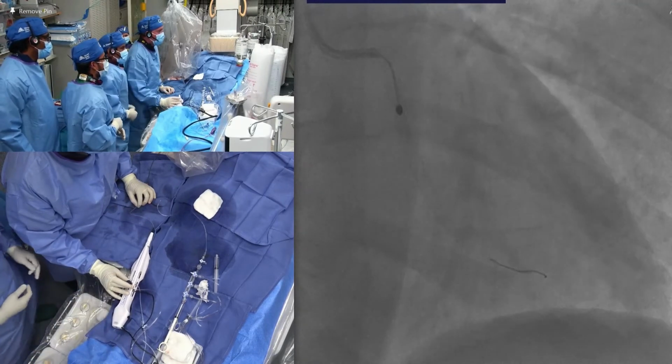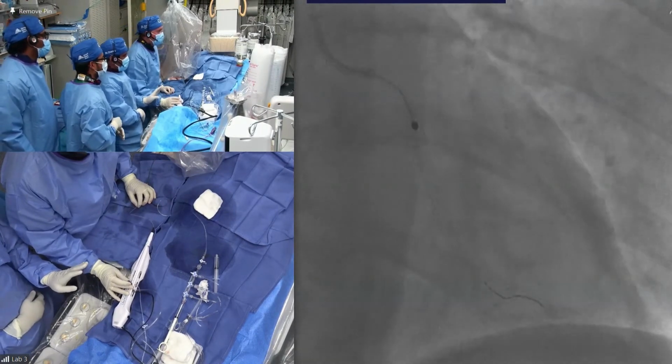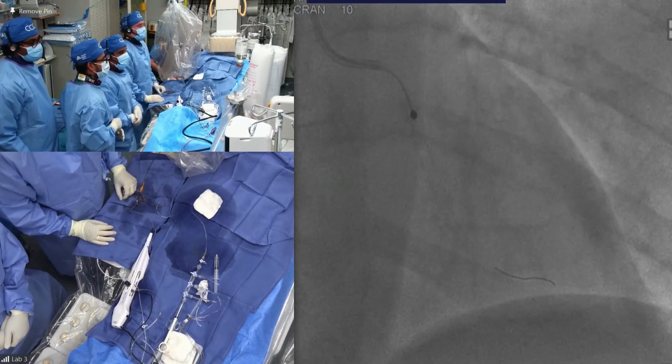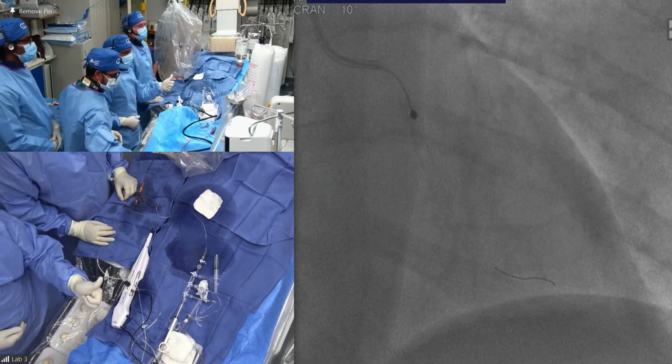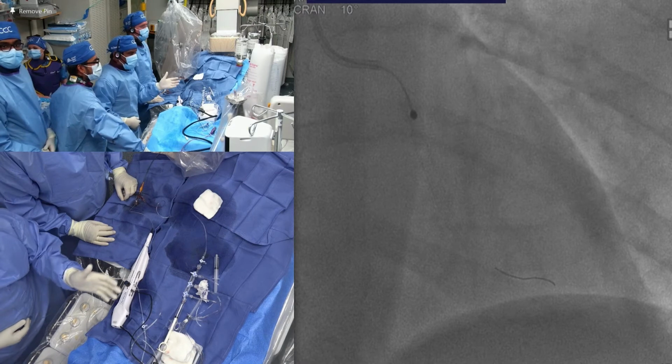Yeah. And I see you don't have a pacemaker here. Are we on the first slide? Yeah, good. So the key is very simple. Radial, we try to avoid a pacemaker. You give aminophylline 300 milligram and atropine 0.6 to 1 milligram.